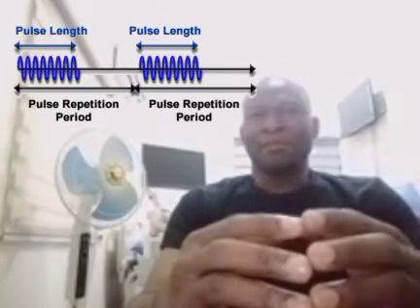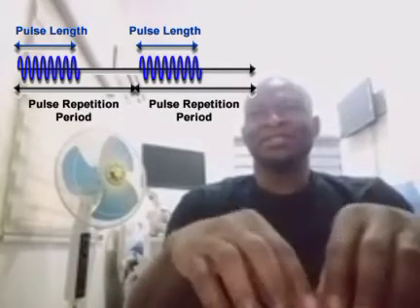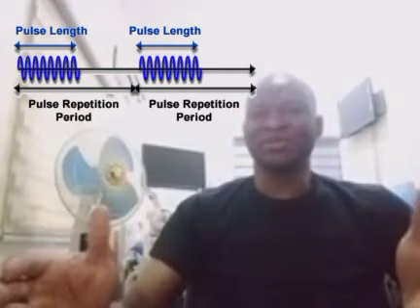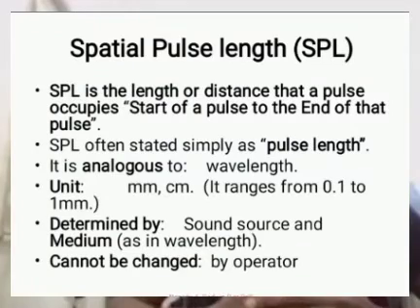Look at spatial pulse length, SPL. That is the length or the distance that a pulse occupies, from the start of a pulse to the end of that pulse. So it's the distance it occupies, yeah? Often it is simply stated as pulse length, which I'm used to. And it's analogous to wavelength, but it's not wavelength, it's analogous to it. The unit is millimeter or centimeter, and it can range from 0.1 to 1 millimeter.